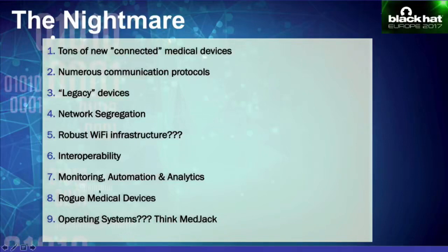Some of the most common vulnerabilities that we have discovered in these devices are default passwords, hard-coded passwords in firmware, and insecure or plain text data during transmission or storage, etc. So just the common vulnerabilities that we have already seen before. And finally, there are medical devices that were never meant to be connected to the network.